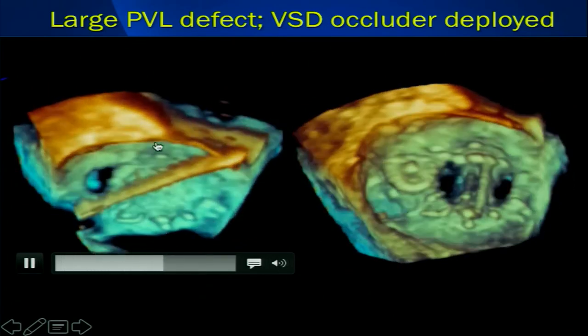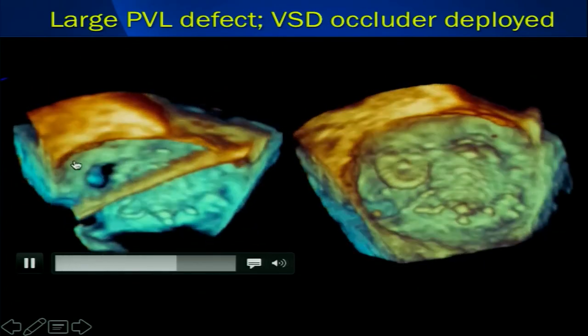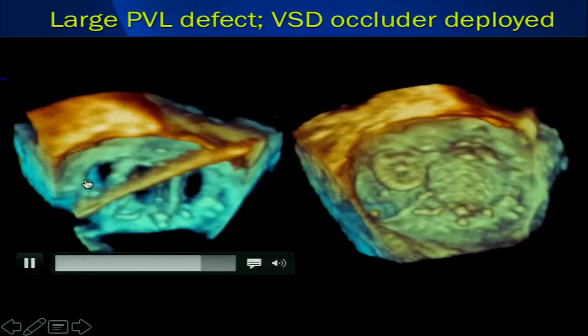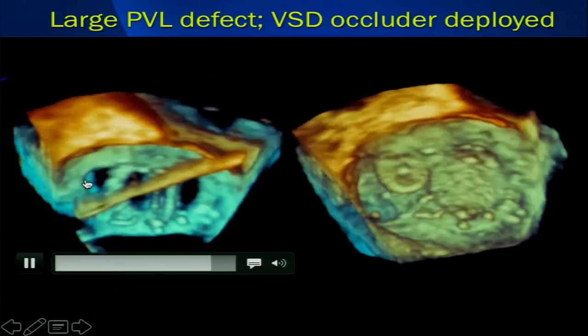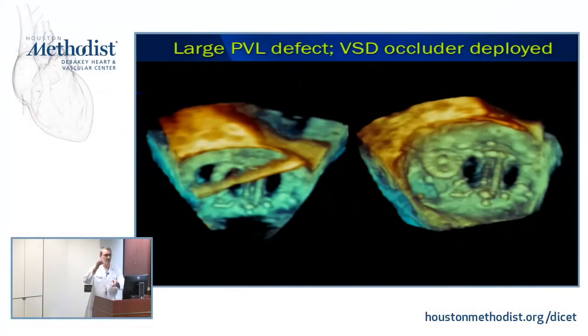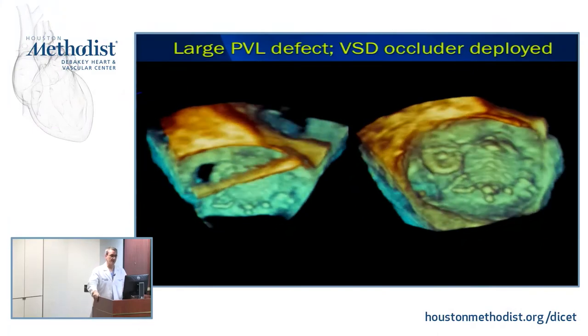So this is the orientation. The aortic valve is at 12. Appendage is usually over here around 10 o'clock. So this is a very common location for a paravalvular leak. This is really at the os of the appendage. So the annulus kind of takes a dive and starts to create this lower rim of the appendage. That seems to be a hard spot for a surgeon to get a good couple of sutures in.